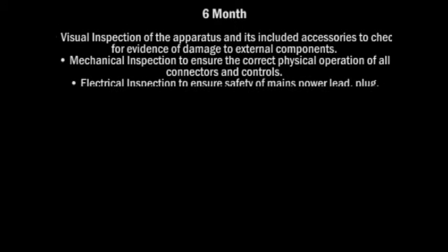Preventive routine maintenance, every 6 months. Visual inspection of the apparatus and its included accessories to check for evidence of damage to external components. Mechanical inspection to ensure the correct physical operation of all connectors and controls. Electrical inspection to ensure safety of main power lead, plug, and all socket outlets.